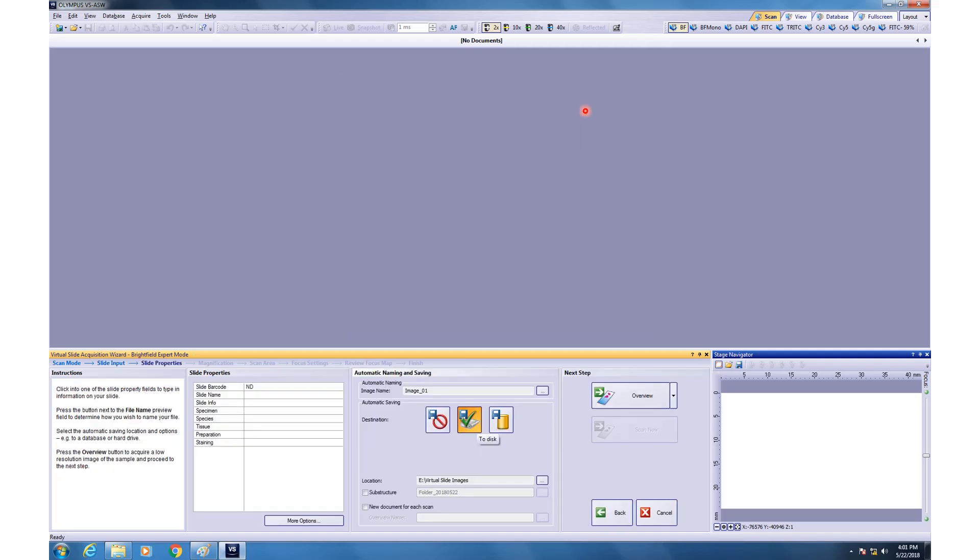After you do that, then you can put in the name of the slide and all the details about it. Whatever name you put in here will be used as the image name. You can add more separators by clicking this option and more and more information about these will be loaded into the name.